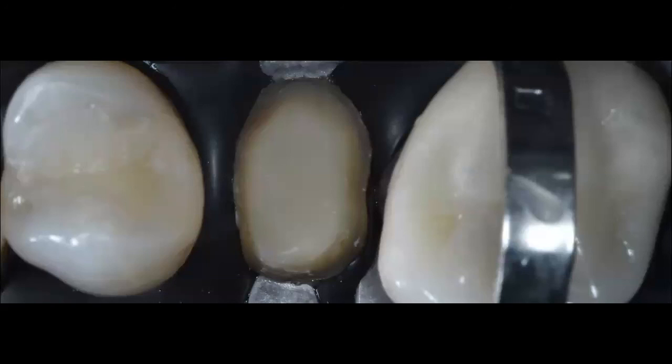Now I have the restoration in my office. 15 days later, the patient comes back. I isolate again. You can see I was able to remove that temporary very easily. Sometimes you can see a little bit of the flowable composite remaining here and there. You just flick it off with a spoon excavator.